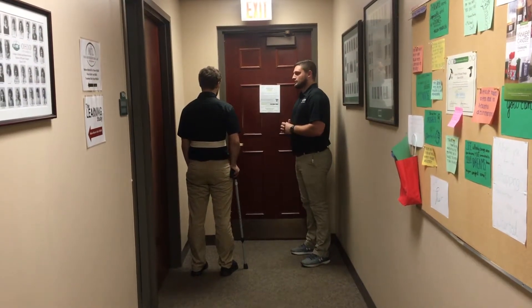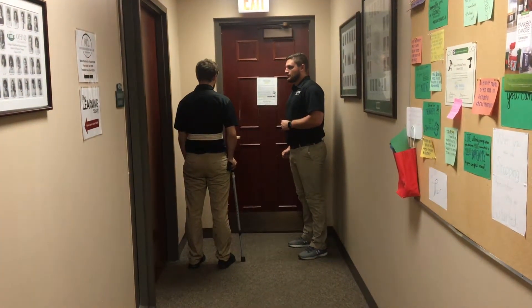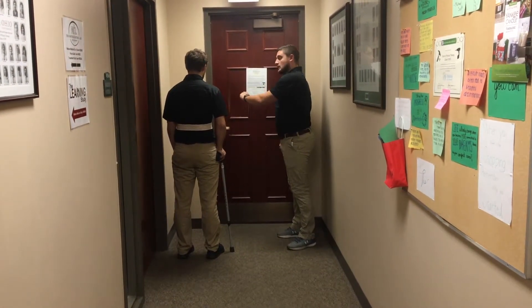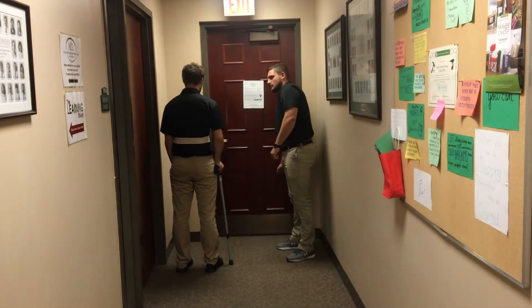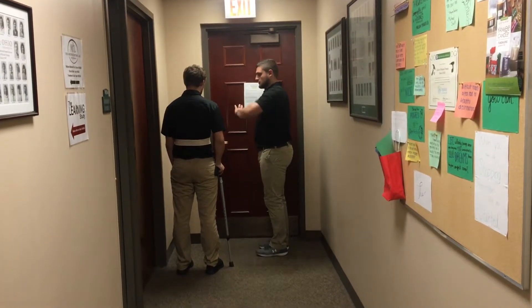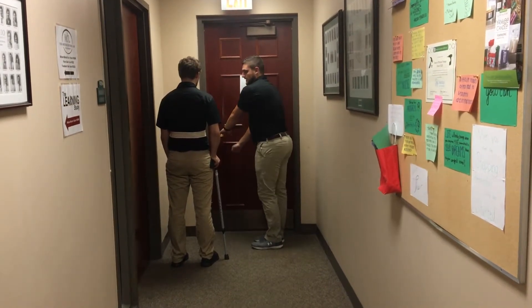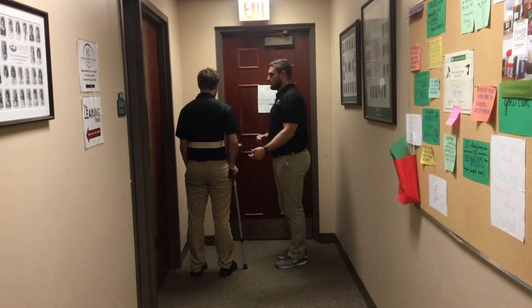Chad, I want you to approach the door. When you get to the door, transfer your weight into the cane. When you transfer your weight into the cane, use your free hand to open the door and swing it wide enough to traverse the doorway safely. As it swings, use your cane as a doorstop against the base of the door. As you walk forward, use your free hand to push the door again, adjusting the cane closer towards the door handle side. As you move through the door, I will be using contact guarding the whole time.